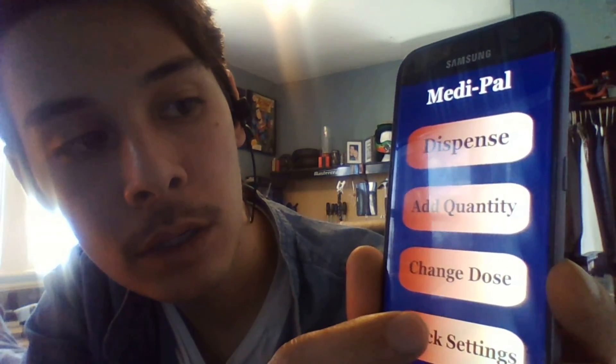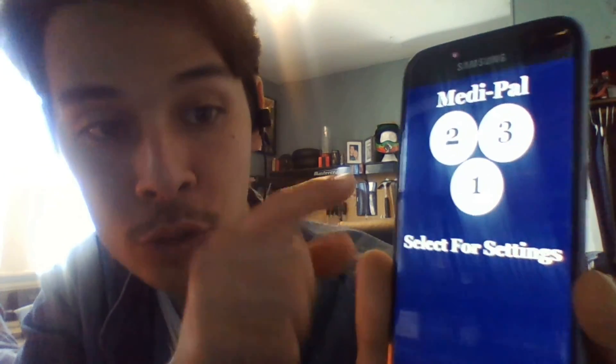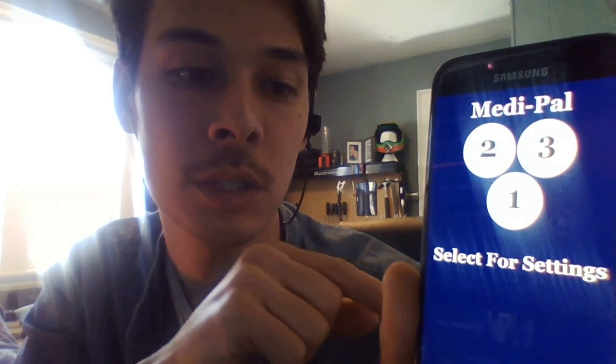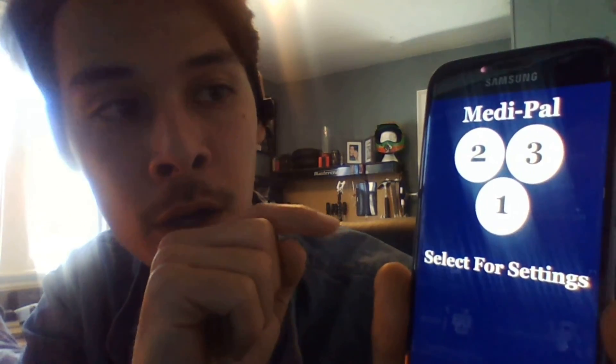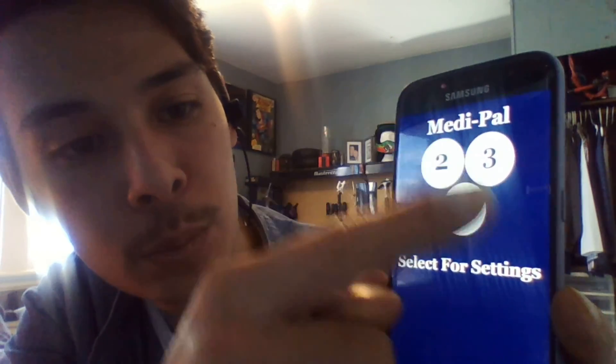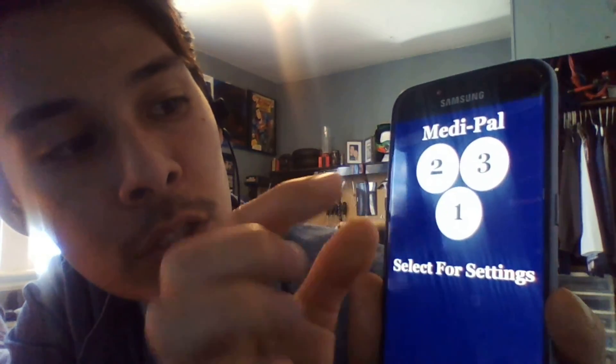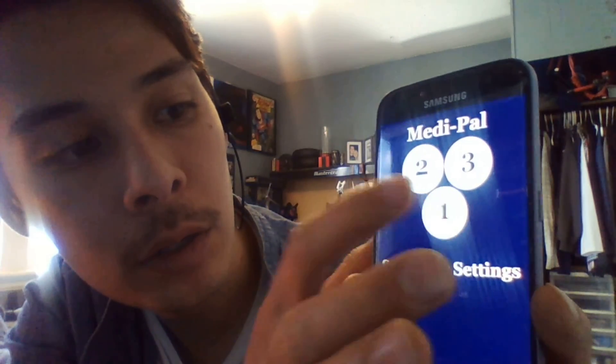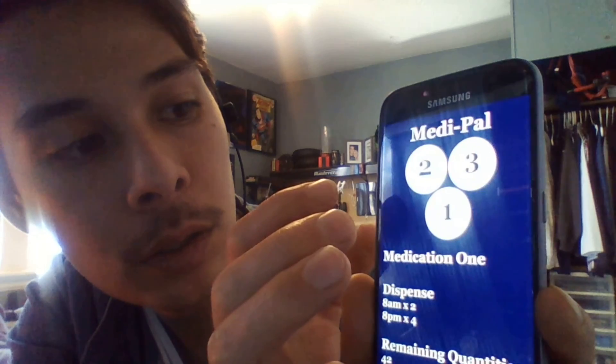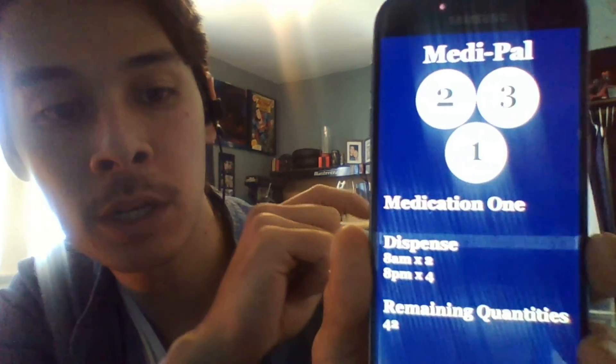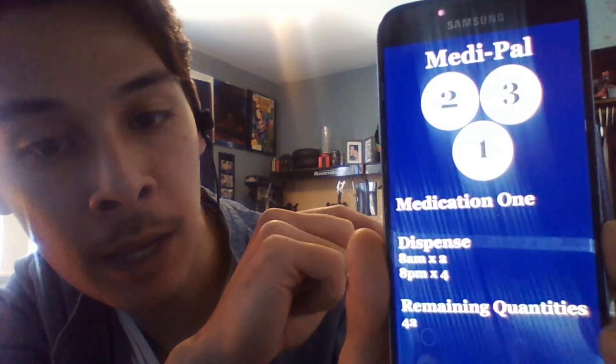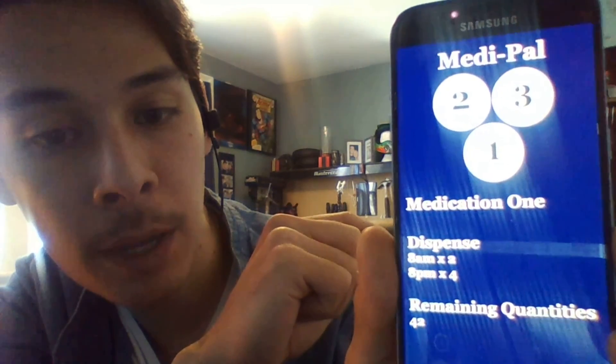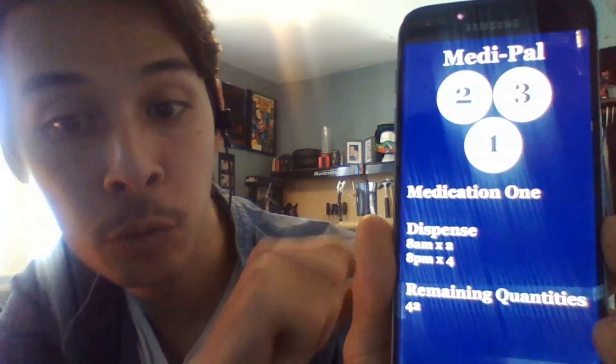Once you're in here, you can see all three of your motors or your medical containers displayed by layout. Let's check medication one. Now on medication one, it shows that it's dispensing two pills at 8 a.m. or 8 p.m., and there is a remaining quantity of 42.